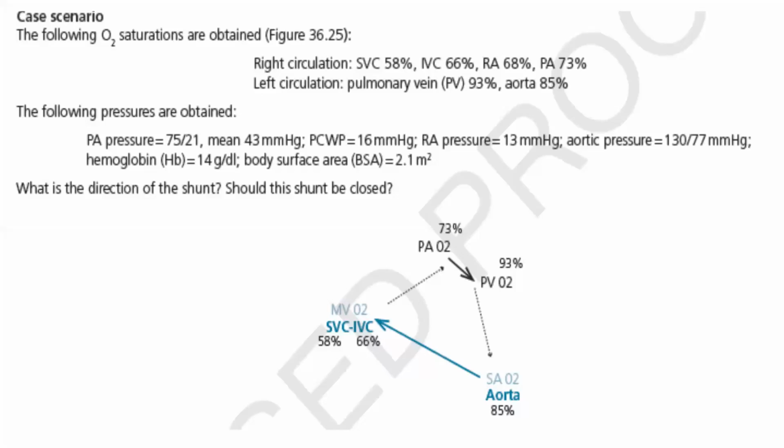So this is a patient with clearly left to right shunt. You have a significant step up, and clearly right to left shunt. You have significant step down. QP/QS will give you an idea of what is the size of the net shunt. Okay, what's the bigger shunt of the two and what's the net shunt? It doesn't size any of those shunts. It only sizes the net shunt. You can still calculate it. I agree it's limited, but we still calculate it.